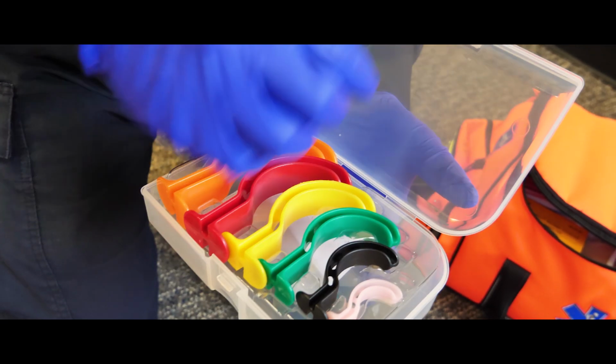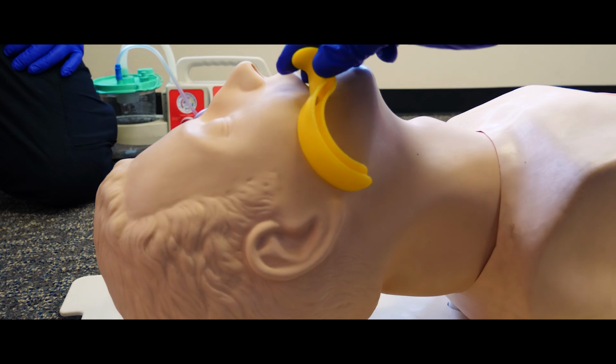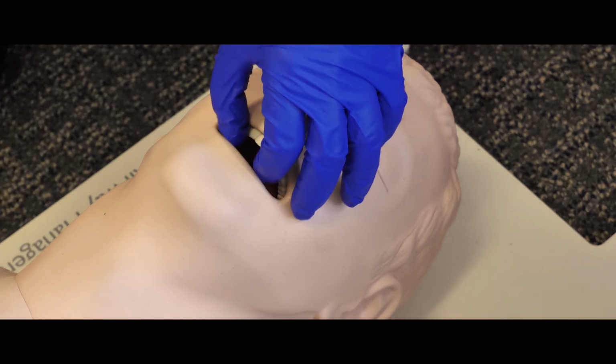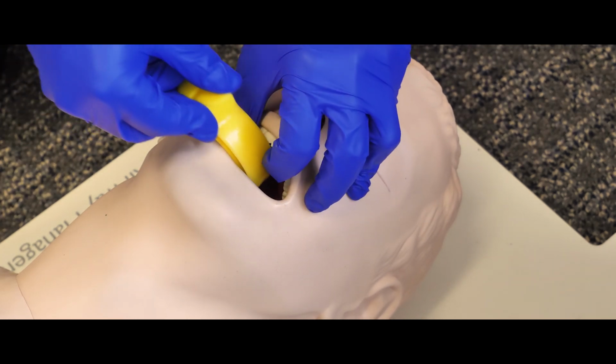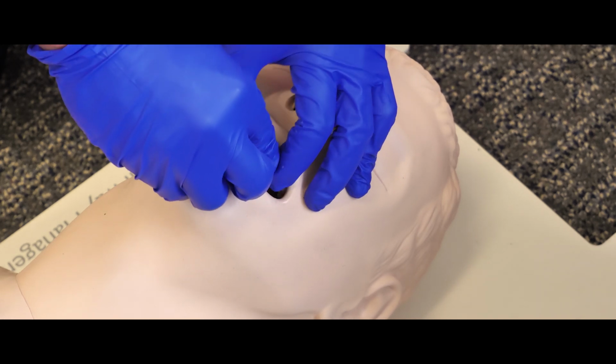After the airway is clear, the EMT measures to ensure the properly sized oropharyngeal airway. This is from the angle of the jaw to the corner of the mouth. The EMT ensures the mouth is open prior to inserting the OPA to prevent damaging the patient's teeth. The OPA is inserted upside down and then rotated 180 degrees to follow the anatomy of the airway.